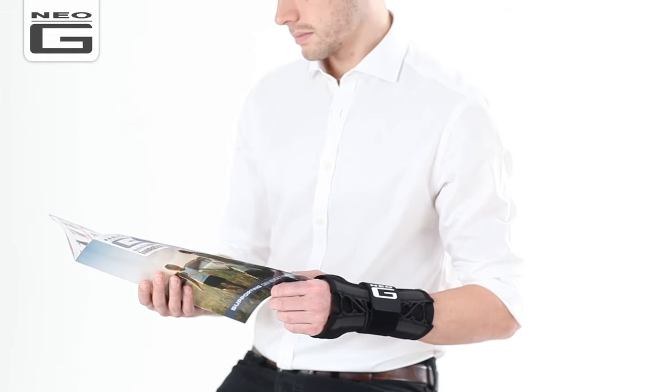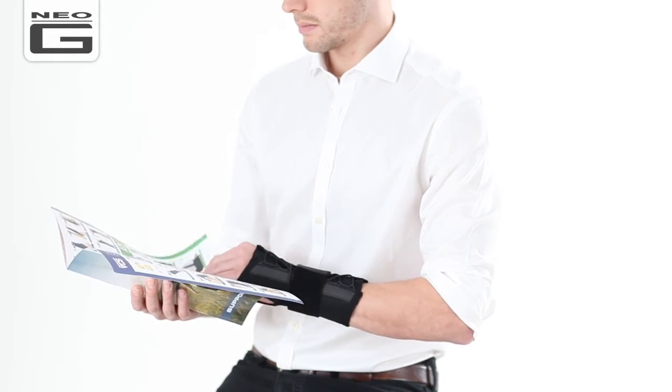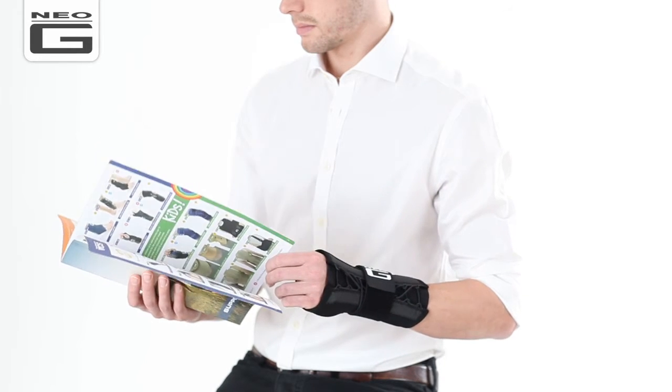Finally, check the support is securely fastened and comfortable. The slimline, lightweight, and breathable design makes the Neo-G EasyFit Wrist Brace ideal for everyday wear.